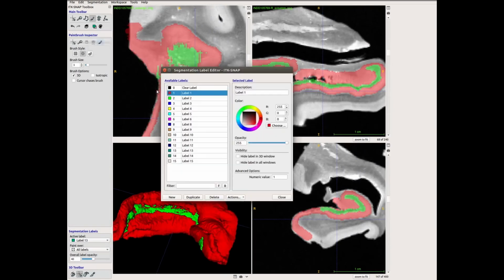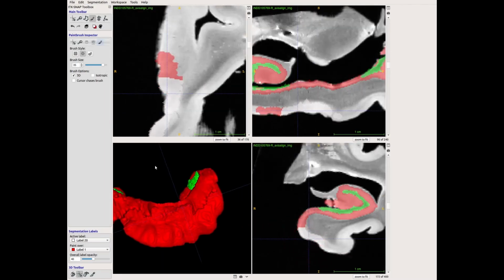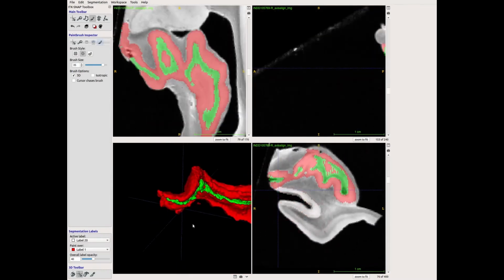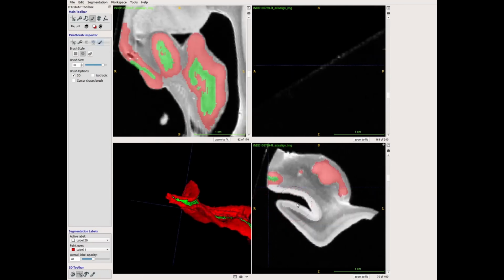Those tools are designed for much lower resolution images though. Initially 0.7 millimeter isotropic, and it seems like it will work across a range of different images, but it won't show the level of detail that we see in this really special ex vivo scan. Here I just wanted to really show what's possible to see with some really good MRI scan like this one.